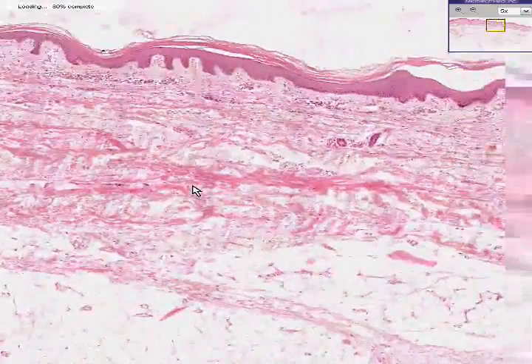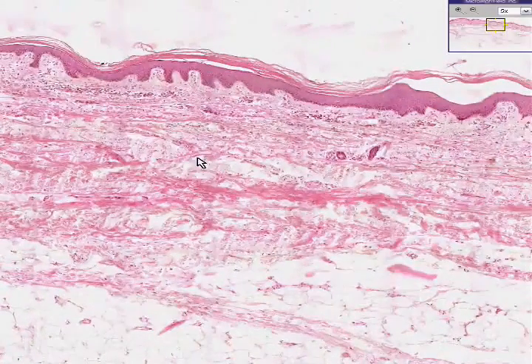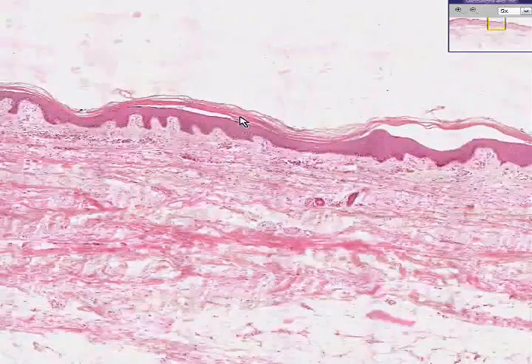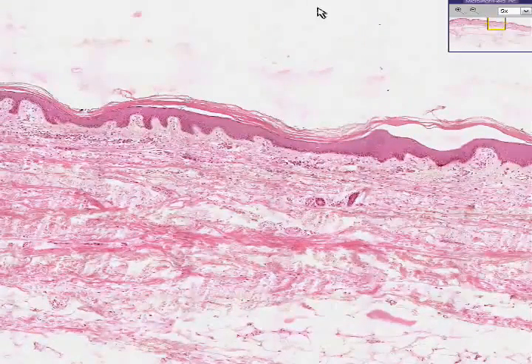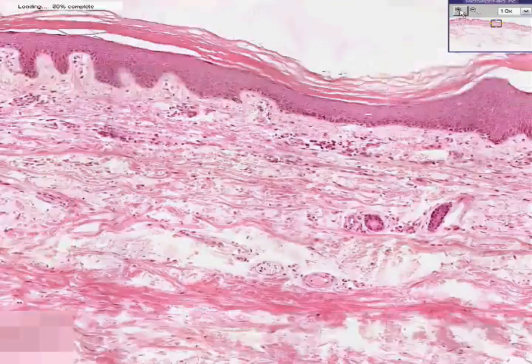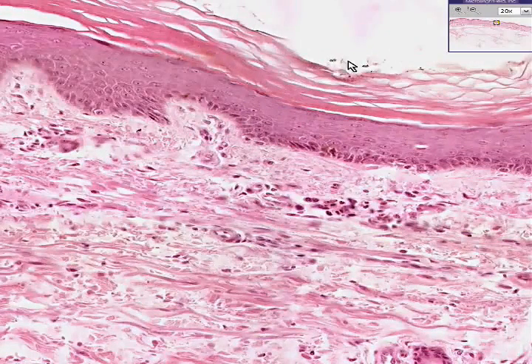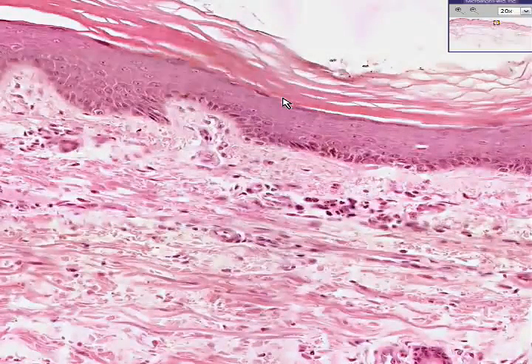Even though we're going to go from top to bottom, classically, when you look at the epidermis itself as the first third of the project, you usually start from the base and go towards the top. And in the skin, the epithelium is keratinized and it's stratified.